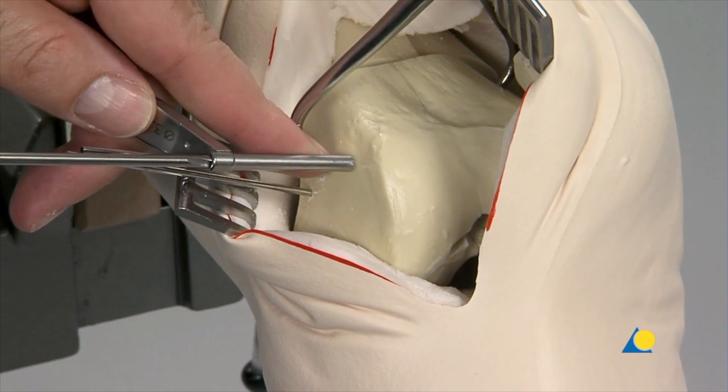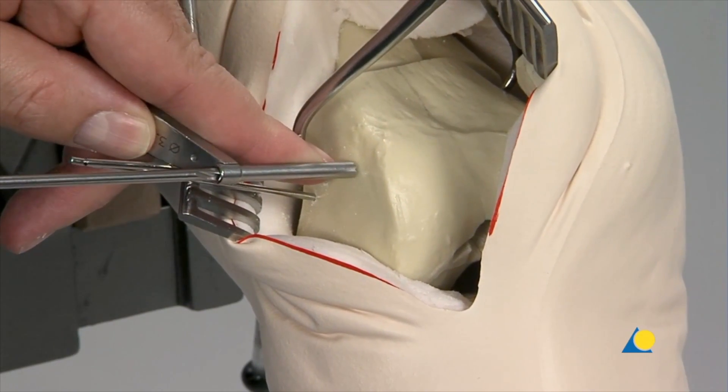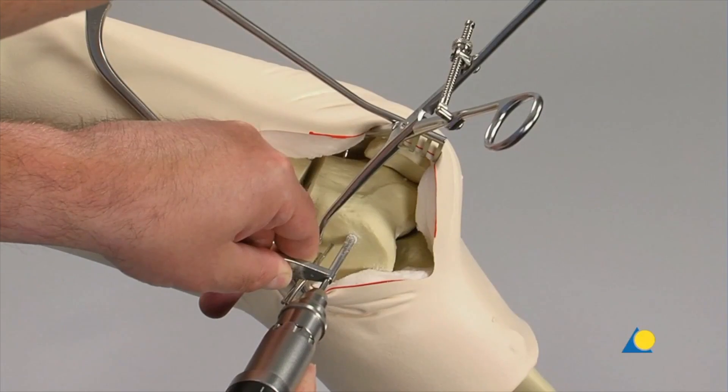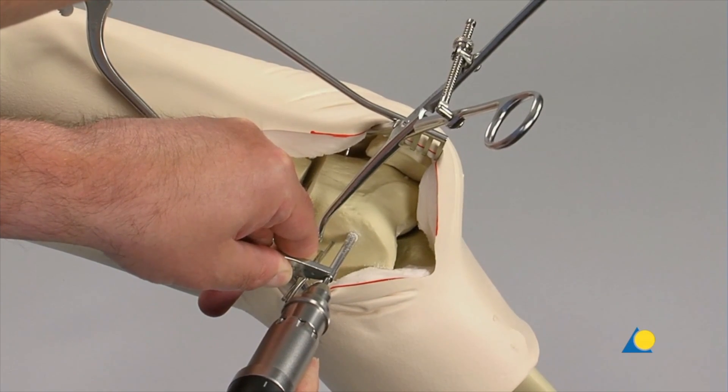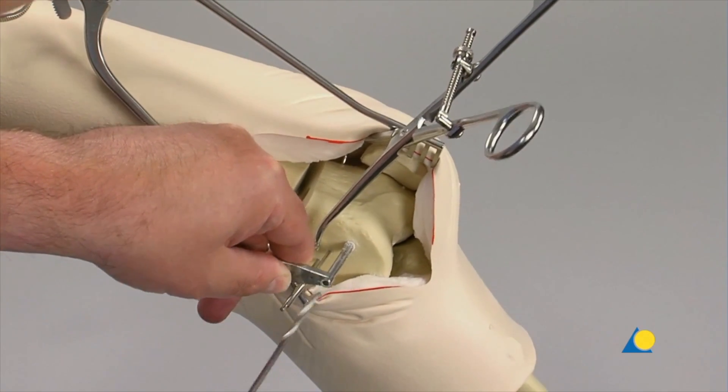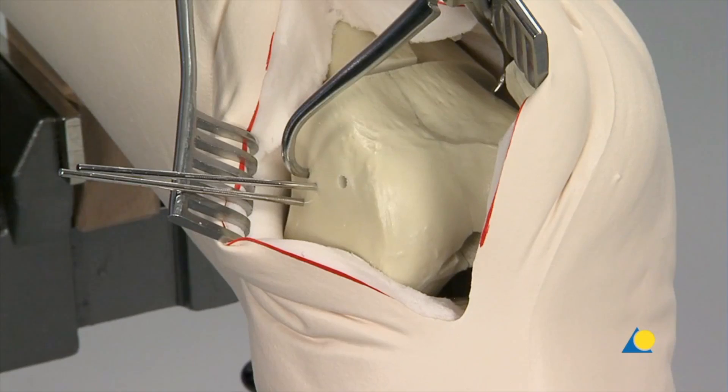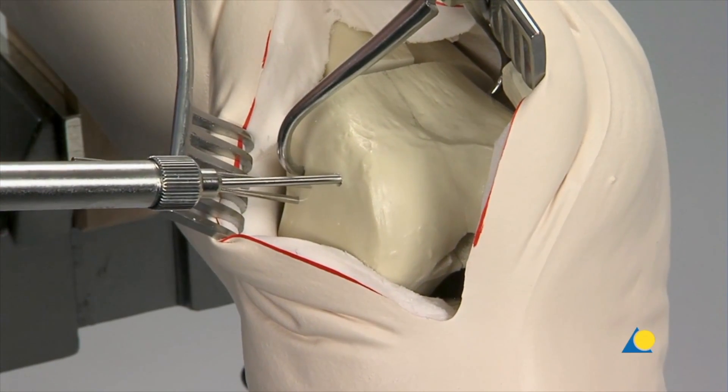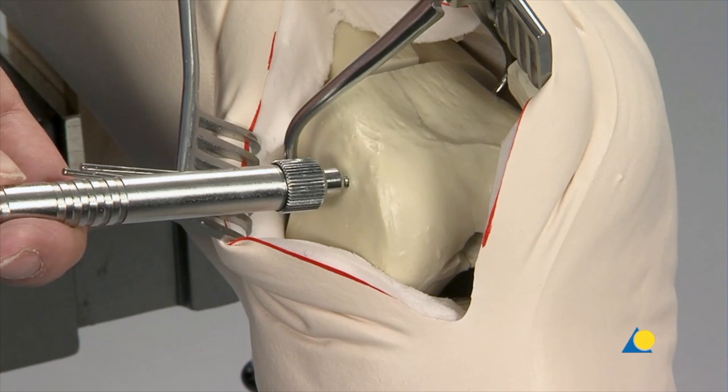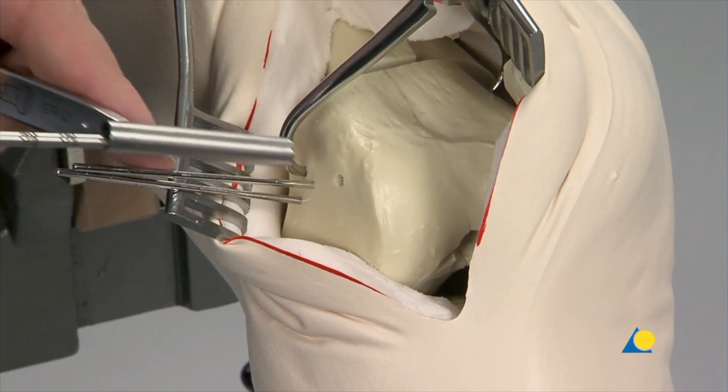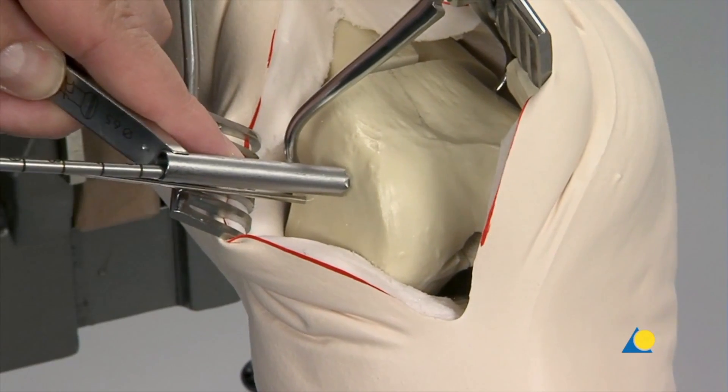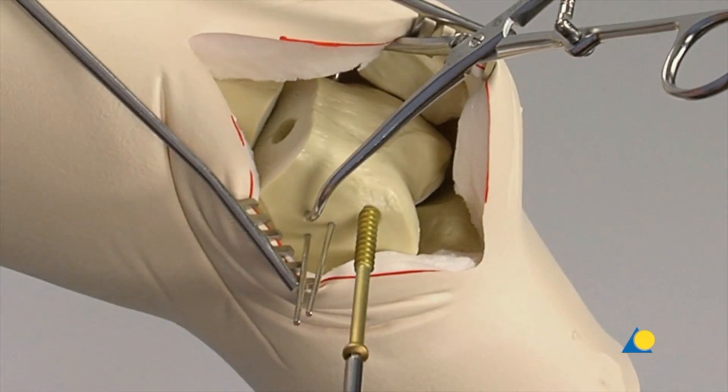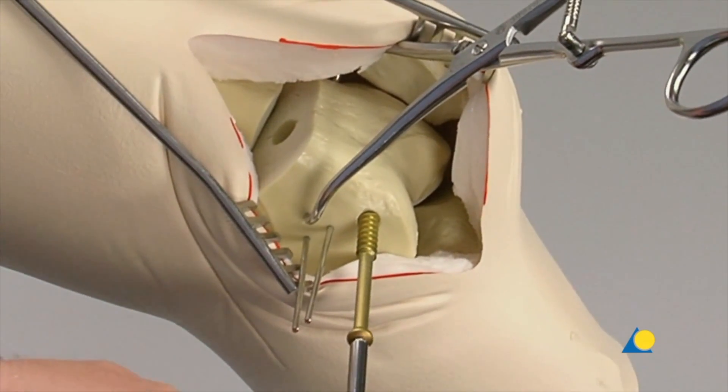For this exercise, two 6.5mm cancellous bone screws with a 32mm long thread are used. The screw hole is pre-drilled with the 3.2mm drill bit, parallel to the level of the ventral condyle. The depth gauge is used to measure the screw length. The threads are cut with the 6.5mm tap.